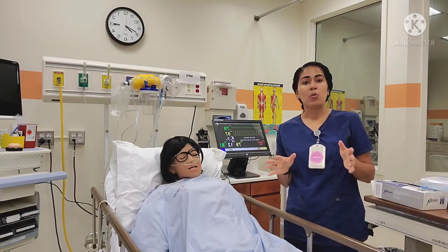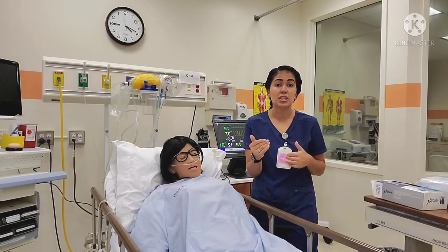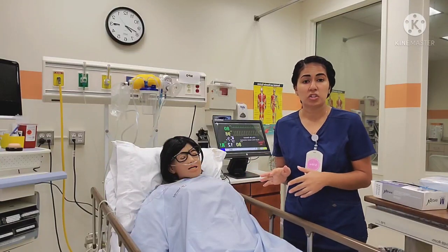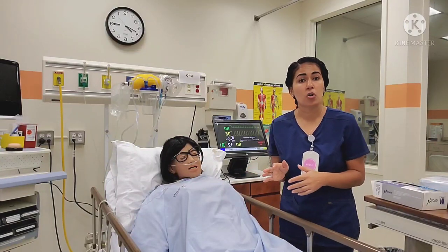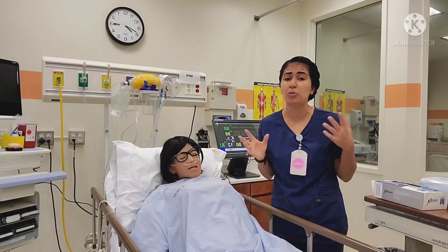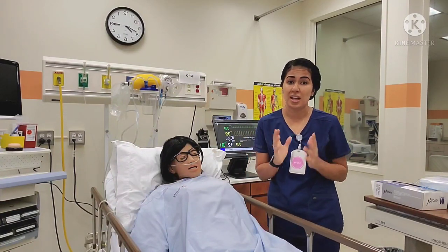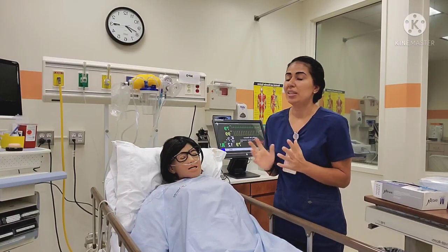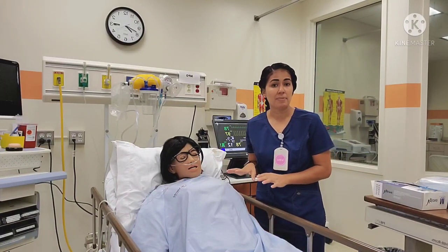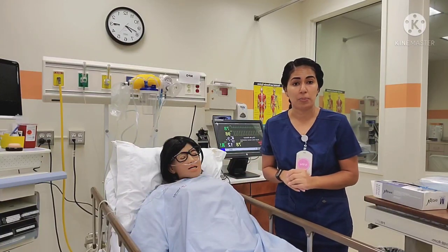First thing — when I receive my order, I'm going to want to think about why does this patient need a urinary catheter. Is it really indicated in this situation? Because we know that urinary catheters cause hospital acquired infections. So if we don't need it, we want to encourage our providers not to order them. In this case, my patient is here with a suspected sepsis and they're inserting the urinary catheter to measure urine output.